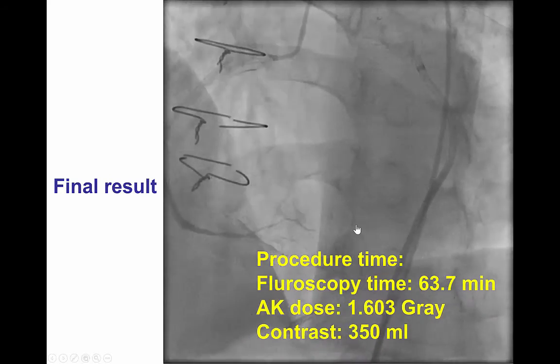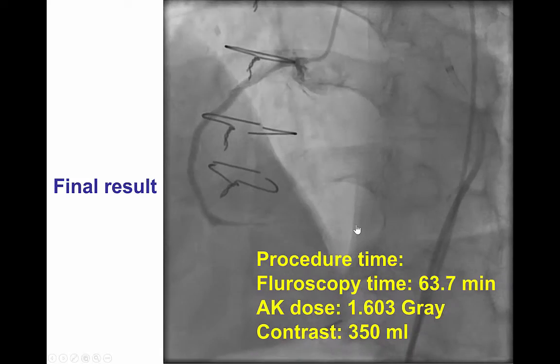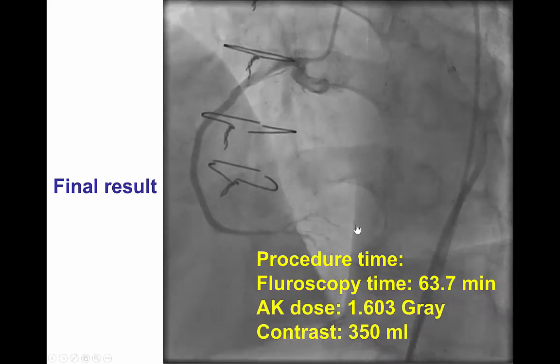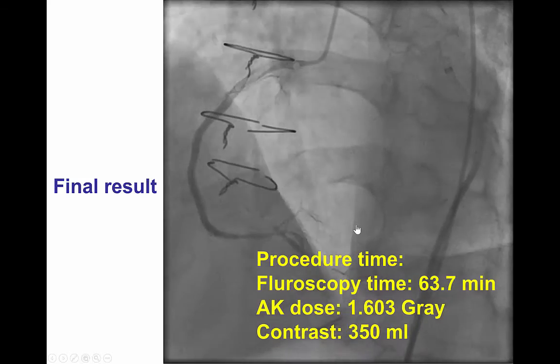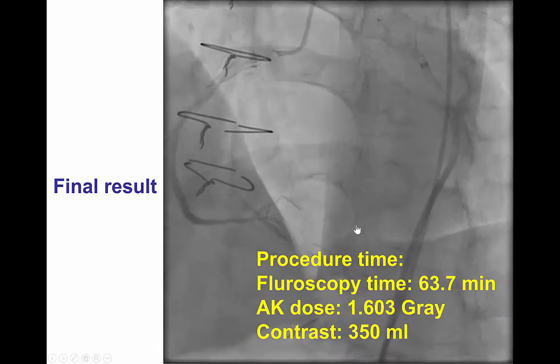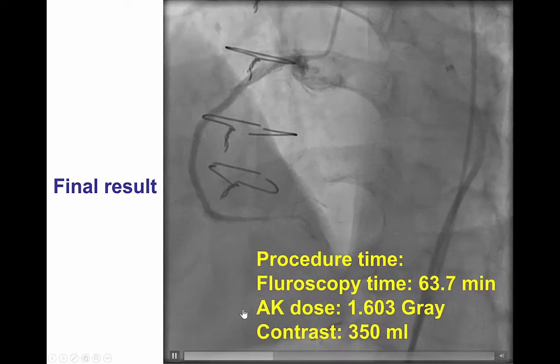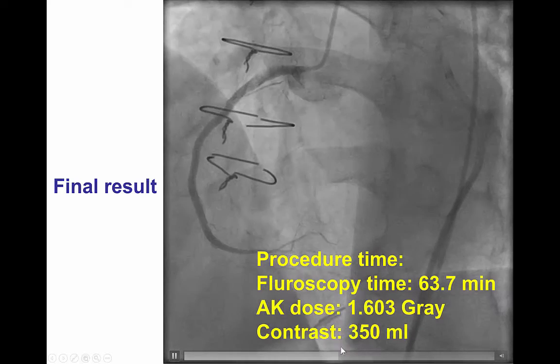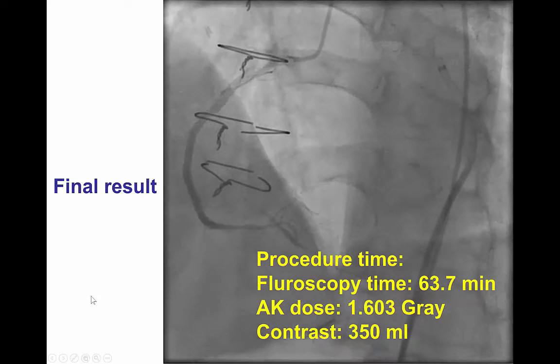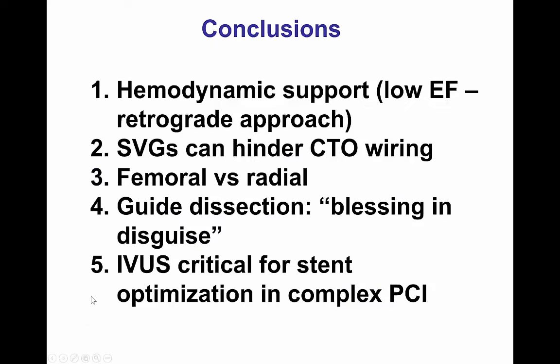Fluoroscopy time was 63 minutes. The radiation dose was 1.6 gray, which is low because we used one of the newer Philips Clarity machines, and 350 ml of contrast was used.